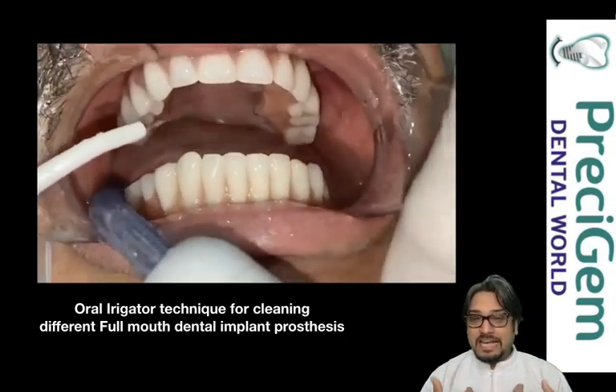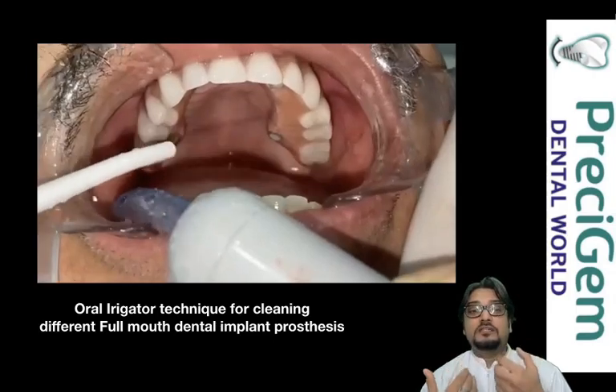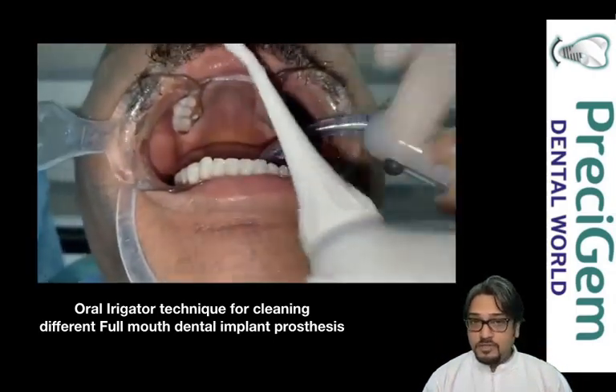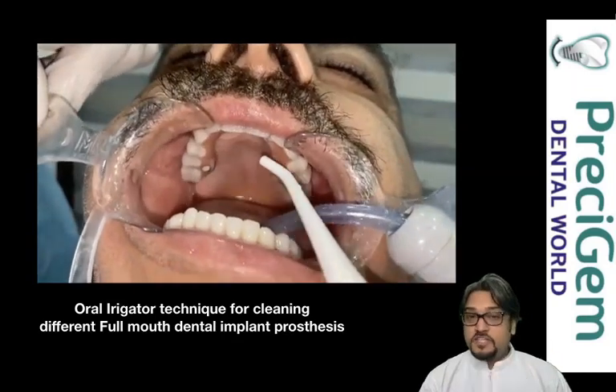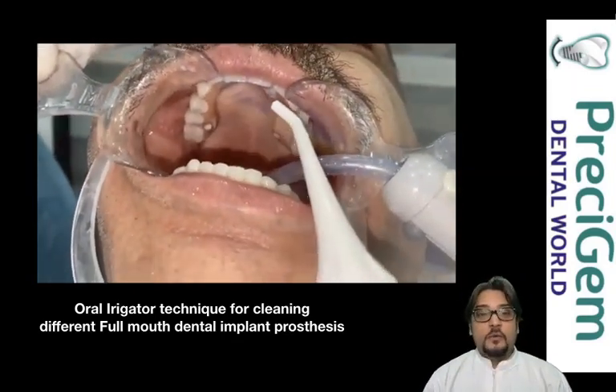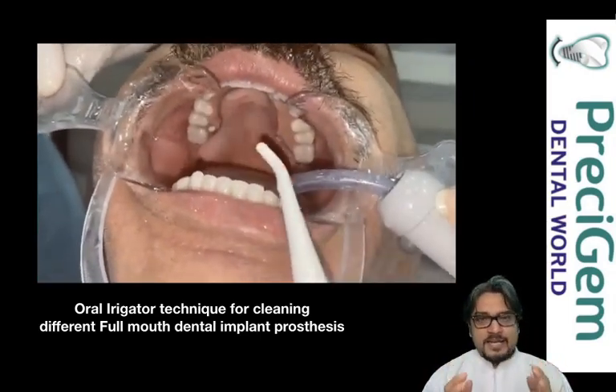You can see perfectly how the water is going in and cleaning the gums and teeth. We are also cleaning the inner part of the upper teeth with the oral flosser so no plaque is retained inside — it can be easily cleaned off.